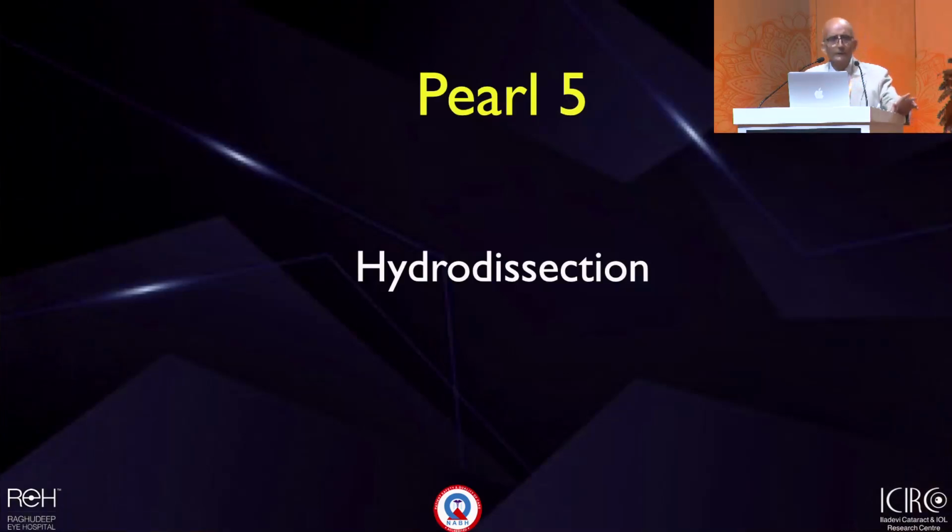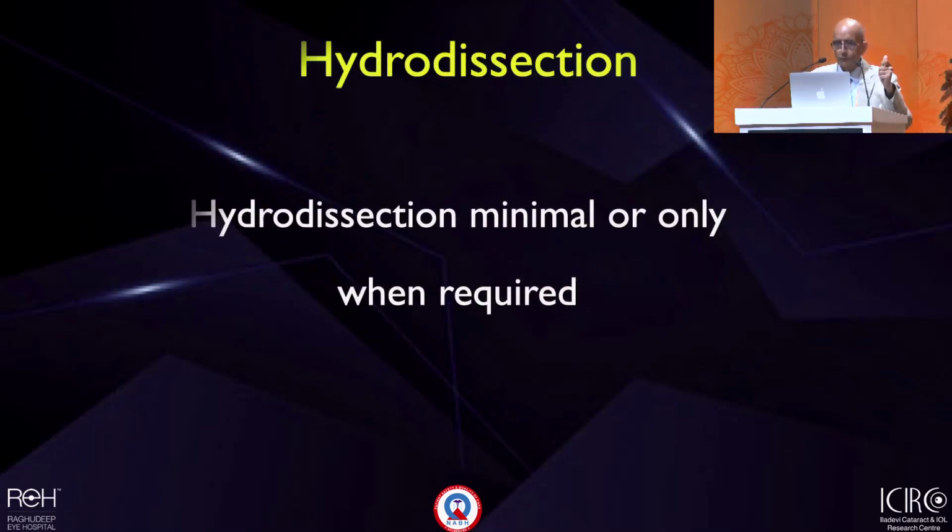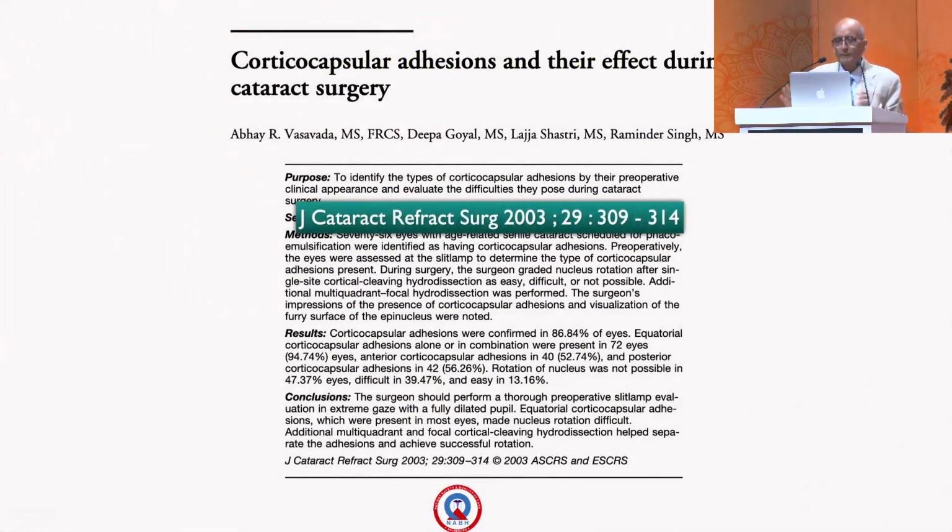Next step would be hydro. Now, there is a lot of controversy. Should I do it? Should I not? Because the bag is so much stretched over the years, and if you overdo it, you might rupture it, intracapsular block. On the other hand, these dense cataracts quite often have a capsulocortical adhesion, and if you do not do it and stress the rotation, you might produce a problem. So I don't know, but what I have now settled down to is to do a gentle hydrodissection, number one, but very gentle, not as forceful as I would do. And if I find that it has gone a little bit at one place, I won't repeat that in another quadrant. And I can always repeat that if I find struggle.